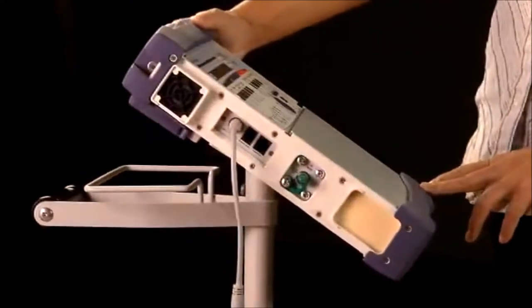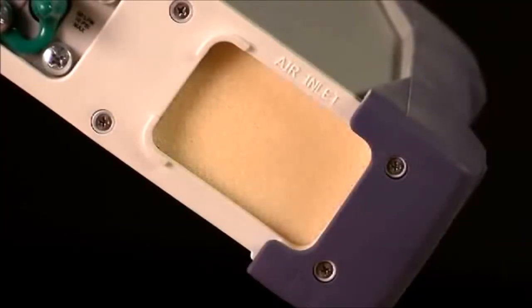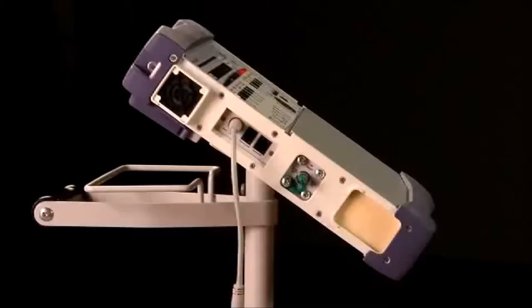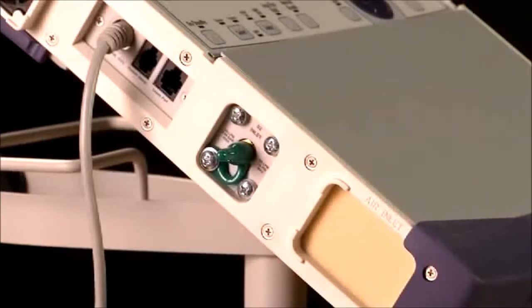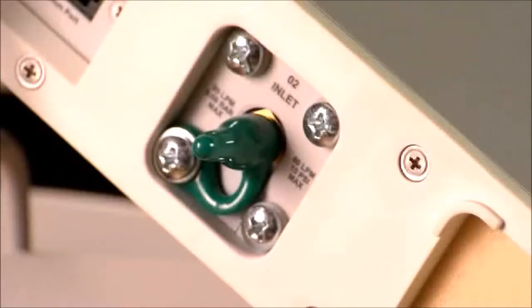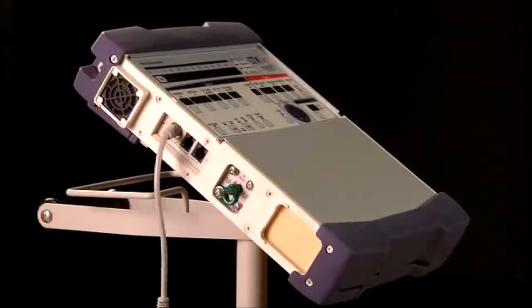On top, there are two eyelets for attaching either the hand strap or the shoulder strap. On the left side of the ventilator is the inlet filter. It is important not to block this filter because this is where the ventilator draws in room air for the patient to breathe. Above the inlet filter is the oxygen port. The LTV 1150 is equipped with a low pressure oxygen inlet. Oxygen from the low pressure source is mixed with the air inside the ventilator. The oxygen percent delivered to the patient is determined by the oxygen inlet flow and the total minute volume and is not regulated by the ventilator.